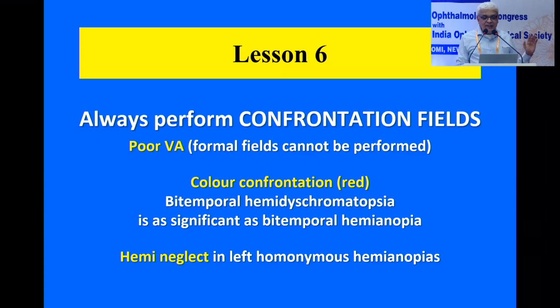The last lesson I have is always perform confrontation fields. Okay, very important. You can say anyway we're going to do a visual field for the patient. We're going to send him for a field test. You can't do a field test in someone who's got say 3 meters vision. So all the more reason for you, the only way you can assess the field is by confrontation. Use color confrontation if possible also.